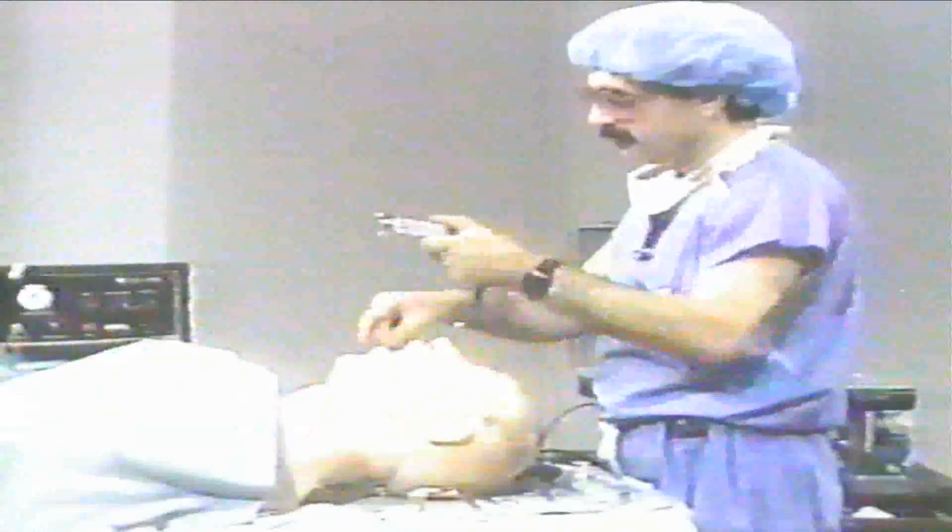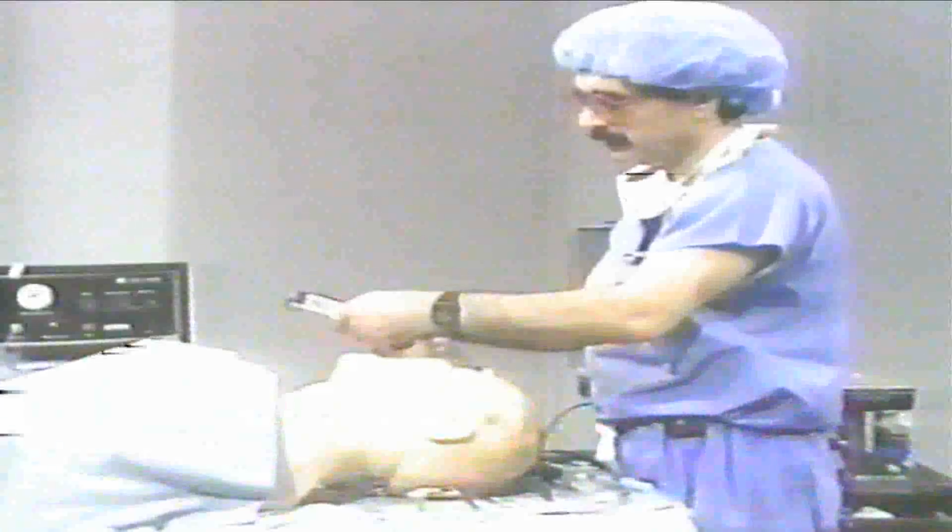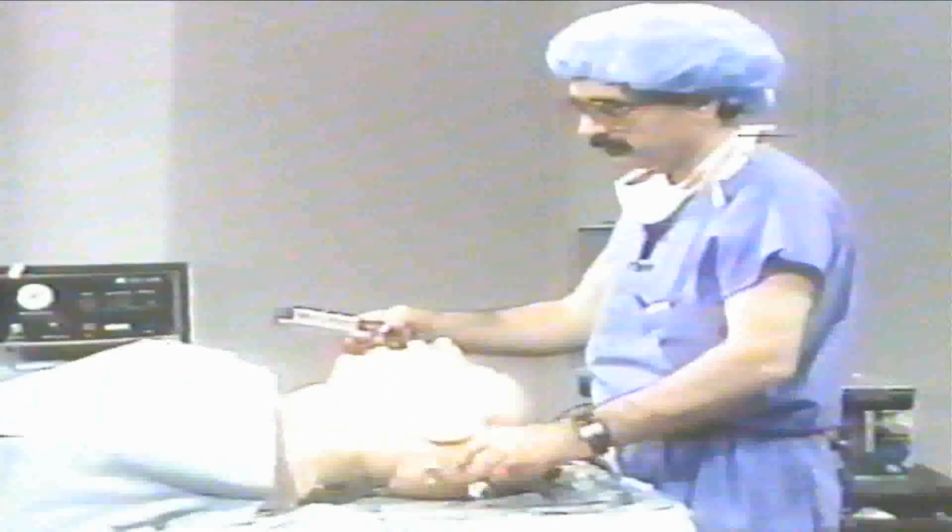Then the mouth should be kept open. We may do laryngoscopy, and an assistant may hold the laryngoscope, or after laryngoscopy we may put this mouth gag in the mouth and the laryngoscope be removed, or use this kind of mouth gag between the teeth. And the tracheal tube may be passed over the fiber optic.